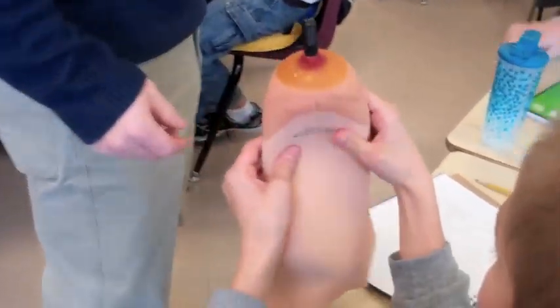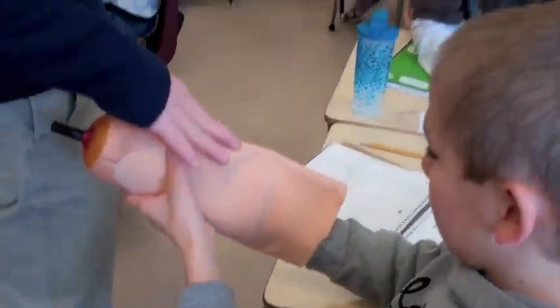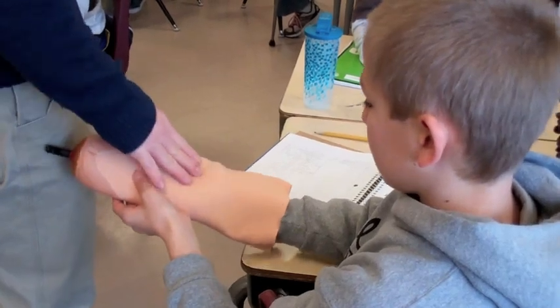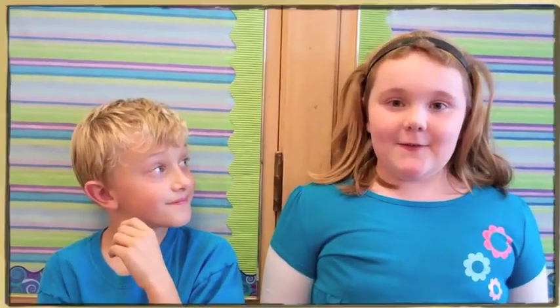We learned a lot from you. I like how the cushioning was crazy soft and the cool designs on the boots. It's a lot like this — it pads it, but feel inside too, it's grippy. The idea is any rubbing is going to be out here on the outside rather than inside. My favorite part was when you put the padding on me.